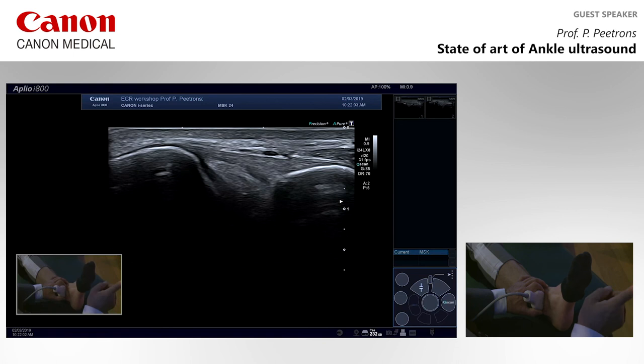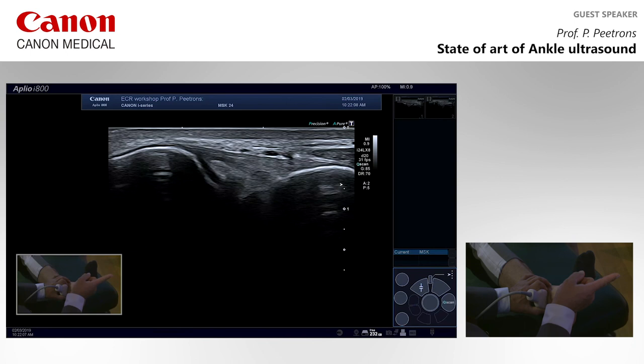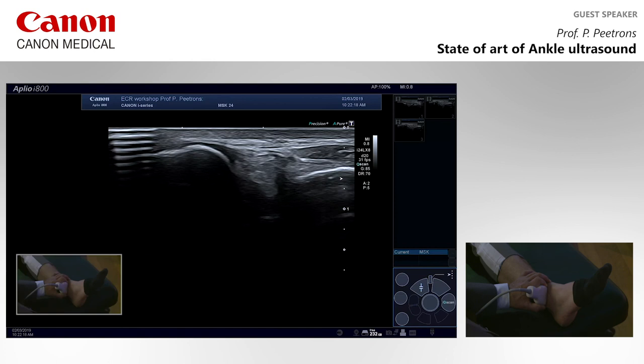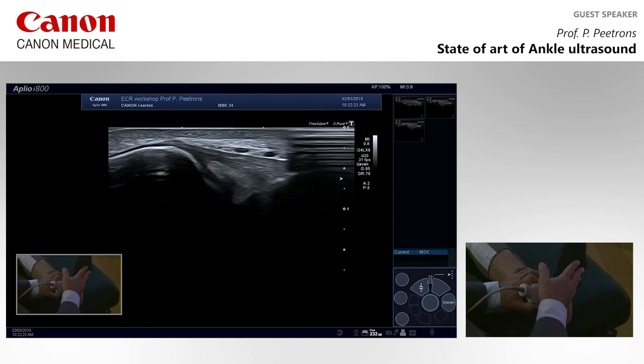It is a little bit bigger on the tibial side than on the fibular side. So if you do like this, you will say, what's in the middle there? I don't know, is it a gap, something like that? Just stress and there is no gap. Don't forget the dynamic movements when you look at a ligament.